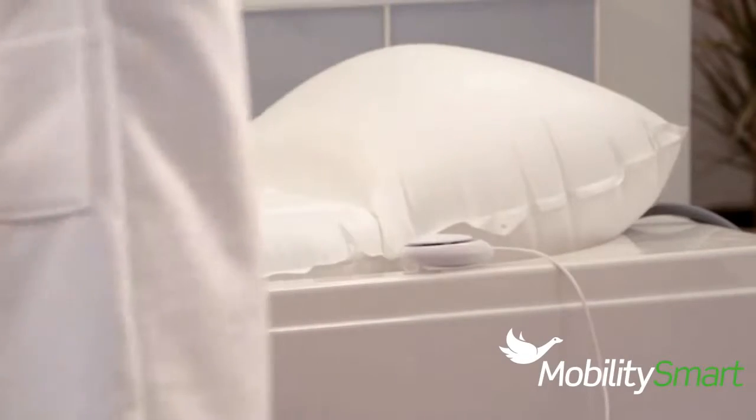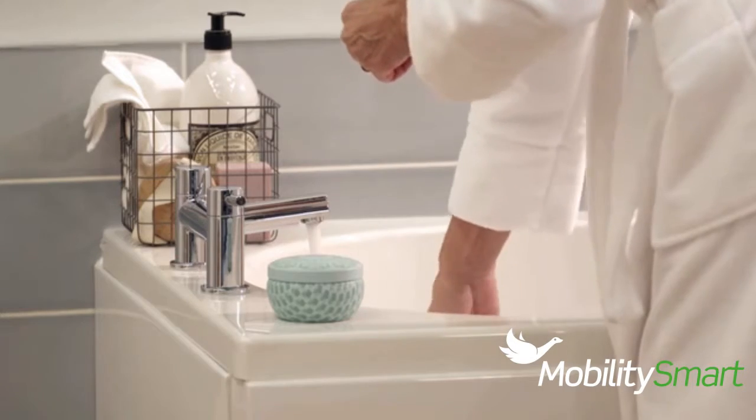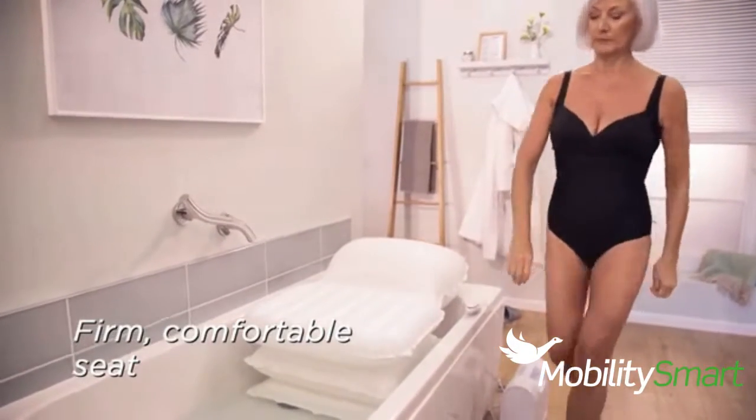Once fully inflated, fill your bath to the desired temperature. The Bath Lift is firm, comfortable and supports up to 24 stone in weight.